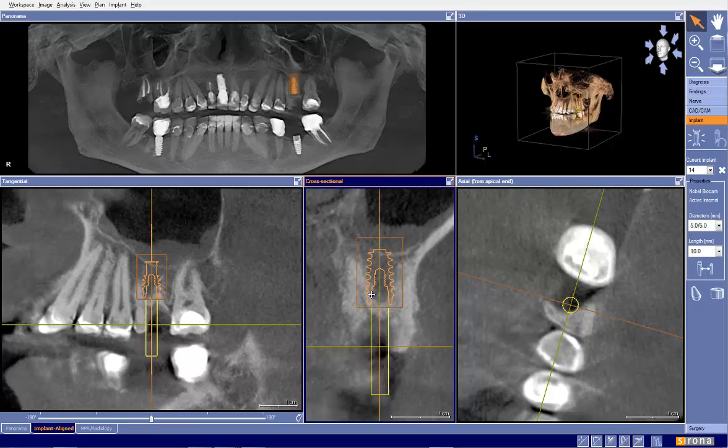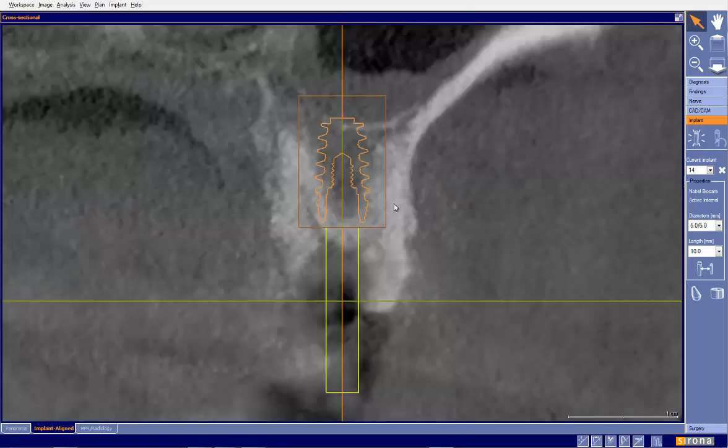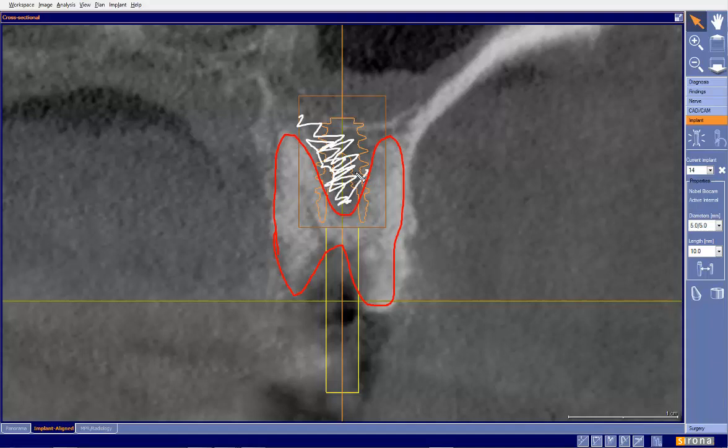So now what I look at is I'm closely looking at this screen right here, and what I'm evaluating here is, I'll use multiple colors, that is tooth right there. Okay. And then now what we have is all of this is fresh bone right there to hold our implant. Now, the bigger question here is how big of an osteotomy are we going to fabricate for this particular implant?